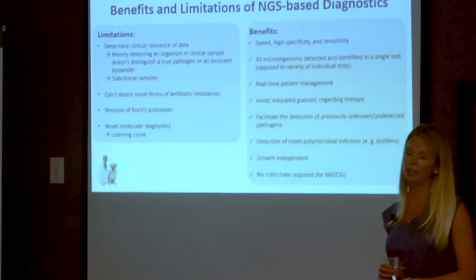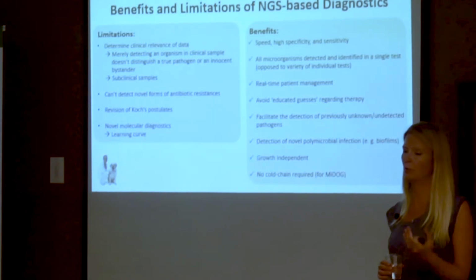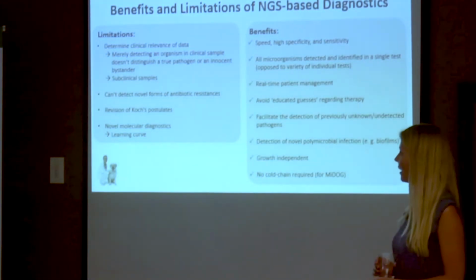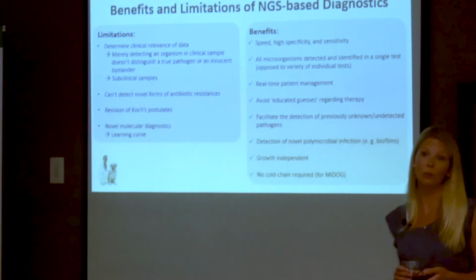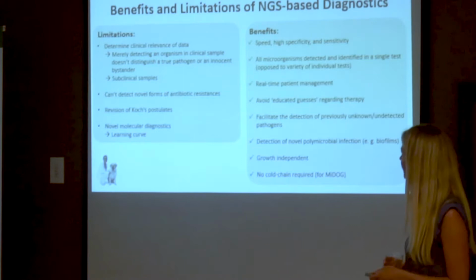It does require a revision of Koch's postulates. It does not apply to the one pathogen, one disease paradigm at all. And there is a learning curve because you find so much more out. You might find novel pathogens that have just not been known before. And so the treatments might need to be adjusted.